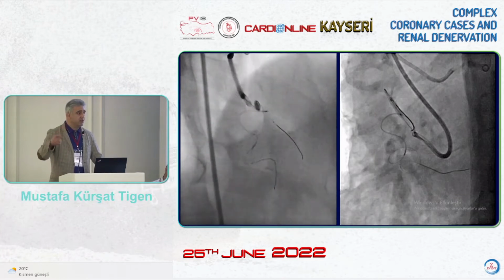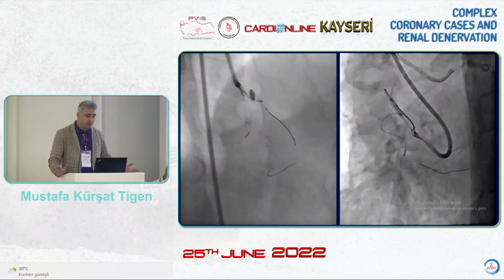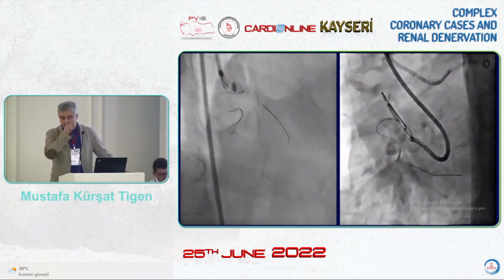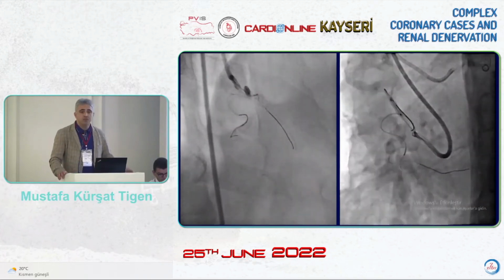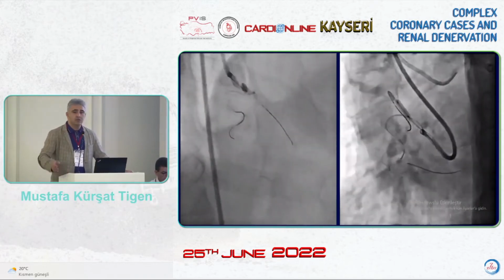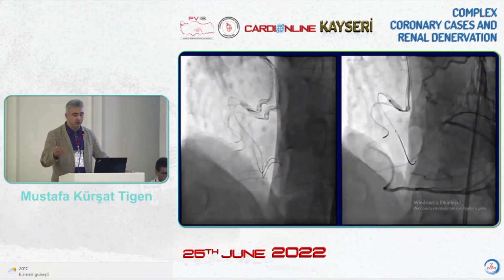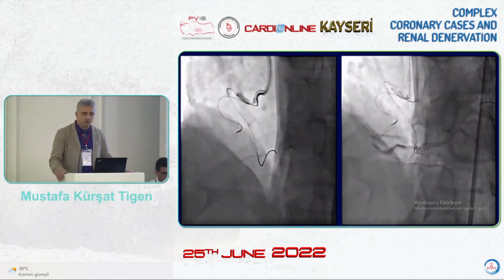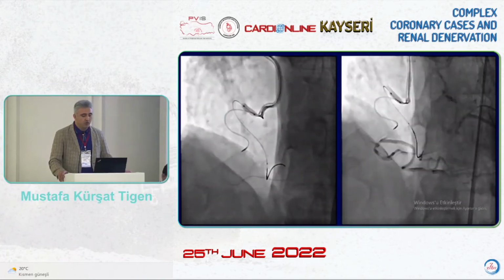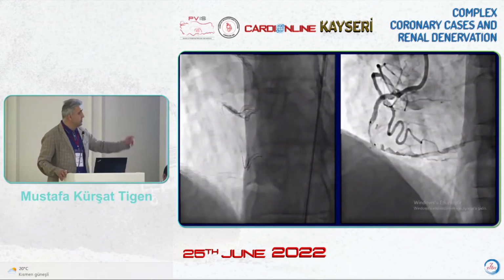There's a lesion, and this is a different, interesting shape here. With the retrograde injection, there is a posterolateral branch we are in, and of course we do not prefer this. This wasn't a branch that we prefer in the system, but when we advance into the posterior descending, we cannot get the microcatheter here with the anchor. The microcatheter is then advanced, and we were successful in this.